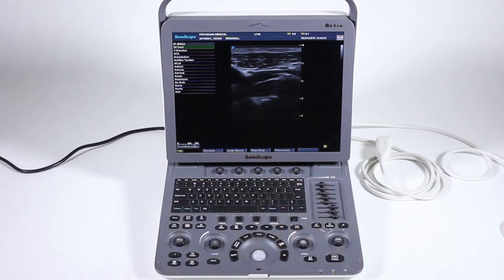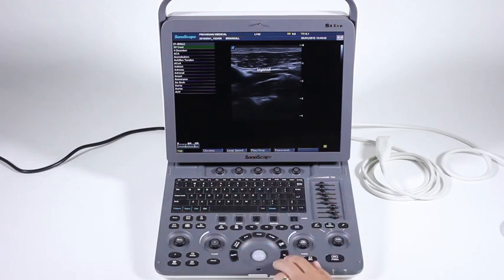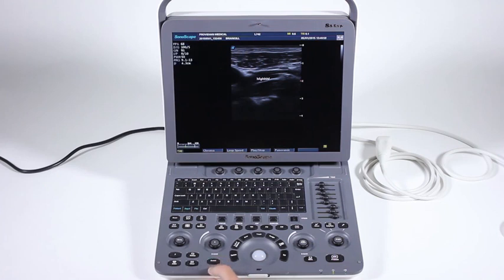If I just want to do a manual one, I just move the trackball around, go ahead and type it in. I'll click set to save it or move it, and then I can save that image or do whatever I want. To get out of annotations, I just hit ANNOT again. To clear that, go ahead and hit clear, and it'll clear that annotation. Now, as we saw with the arrow earlier, you can press arrow, move it around, click the set key, and if I want to add another arrow, I press it again, and I can rotate that arrow this way. Press the set key, hit clear to clear the arrows.